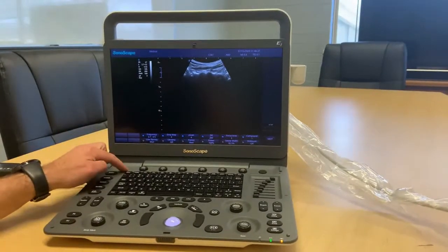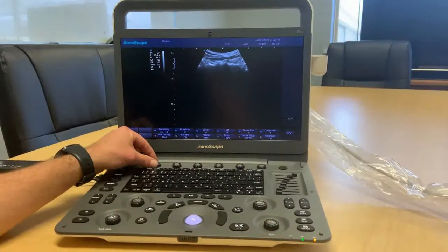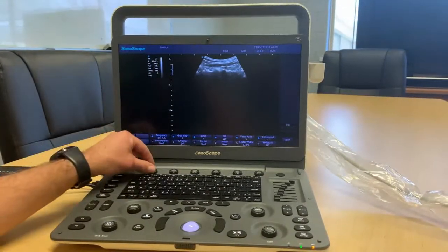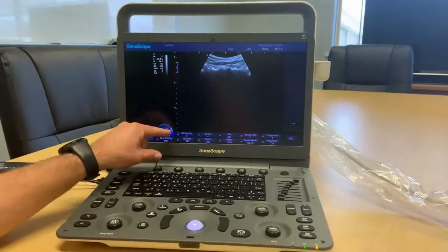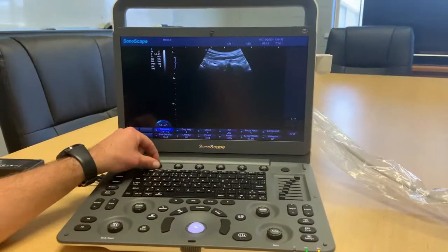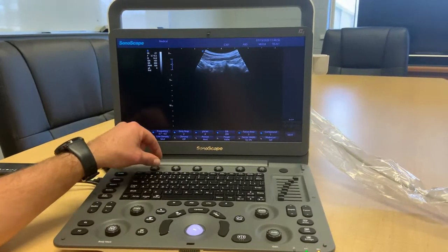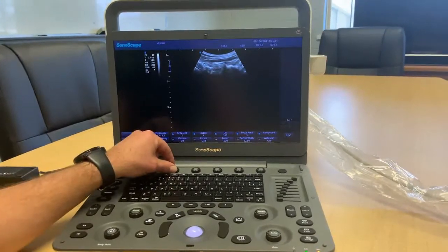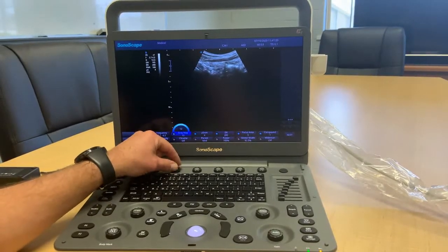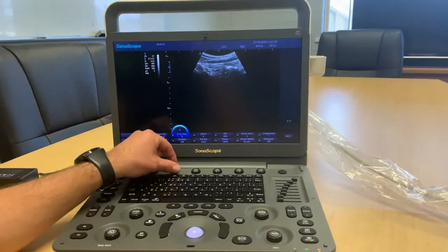Returning to frequency: the frequency dictates the depth of the image. The shallower the image needed, the higher the frequency. This probe goes from 3.5 up to 5.5 MHz, and you'll see the numbers tick through as you change it, altering the image accordingly. The grey map is another feature you can use — it changes the grays that appear on the screen, and you just pick whichever works best for your imaging situation.